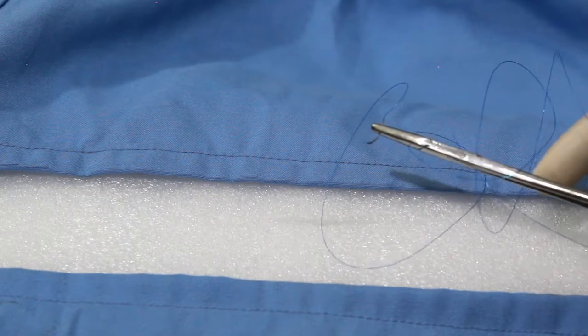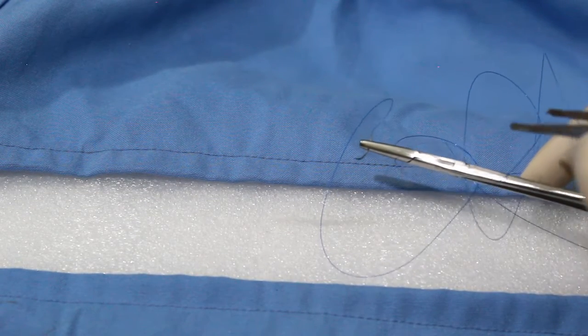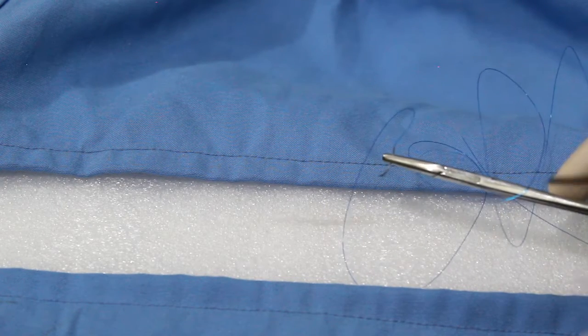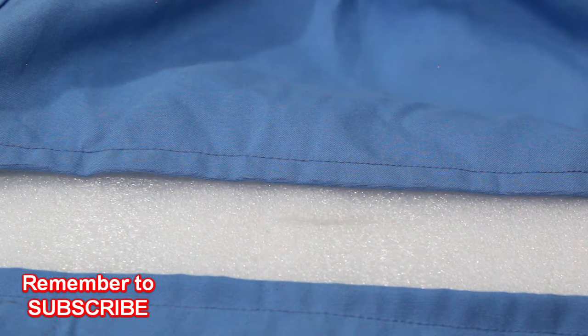Always use the thinnest suture material possible to minimize the risk of track marks and foreign body reaction. The most commonly used suturing technique is used for approximation of the epidermis of a wound — for epidermal approximation under moderate tension, such as in lacerations and punch biopsies. That is the interrupted suturing technique.